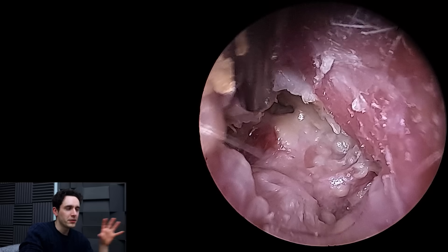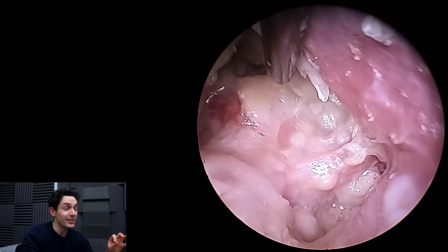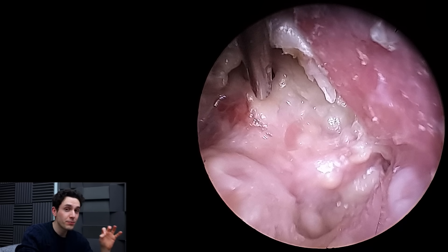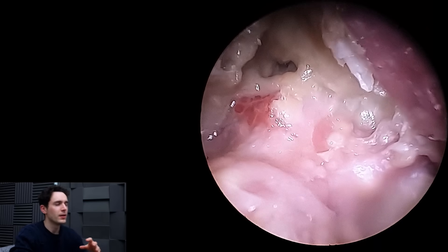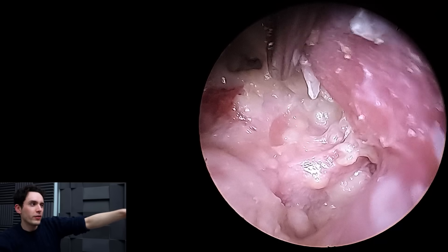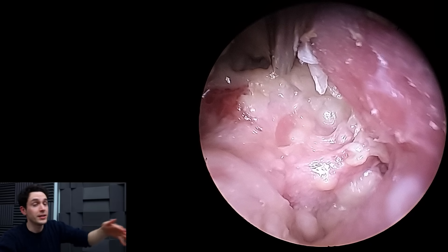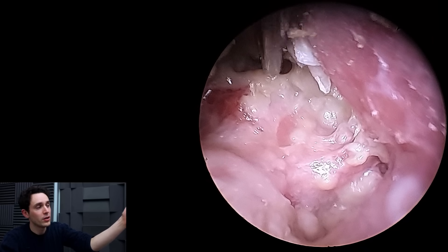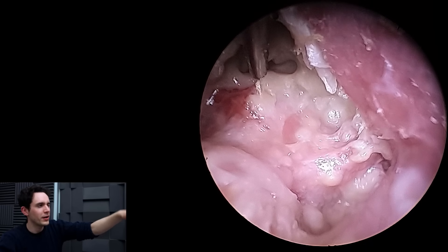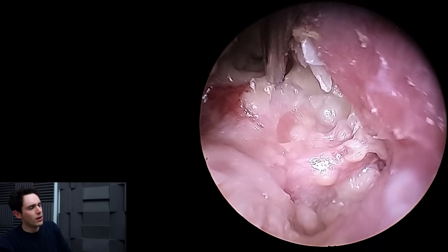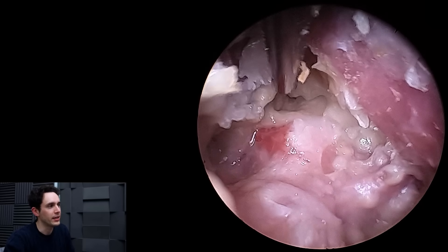Also, it doesn't come across in the video, but this guy's mastoid cavity is tender — it's really sore. The slightest bit of pressure in the wrong area and he's really uncomfortable. Right here where the suction probe is resting on this bulge on the right-hand side — he does not like that. The slightest bit of pressure on this bulge, which we think is roughly where the TMJ is — he does not like that. So I'm really having to tread very, very carefully here.